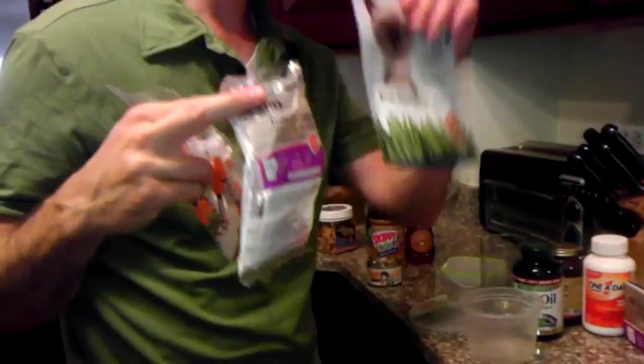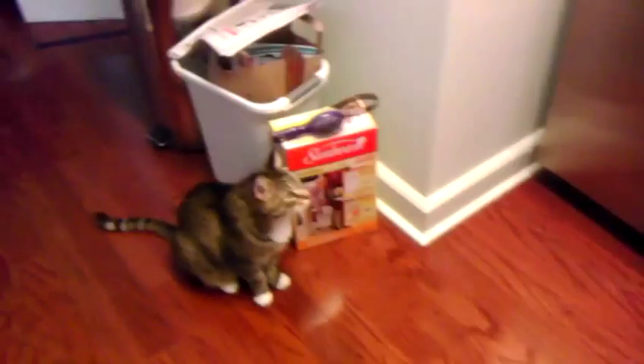So now this is Peanut's insulin routine. I'm going to go into the cabinet over here. On the left side is used syringes, new syringes, and his bag of treats. Peanut is eagerly waiting behind us. And in the top shelf of the refrigerator is his insulin.